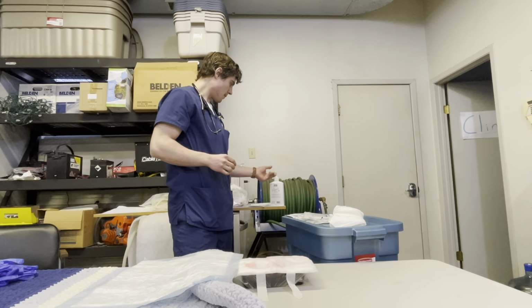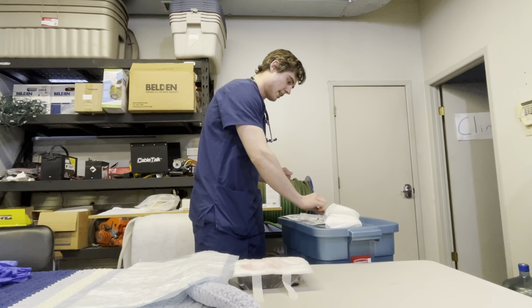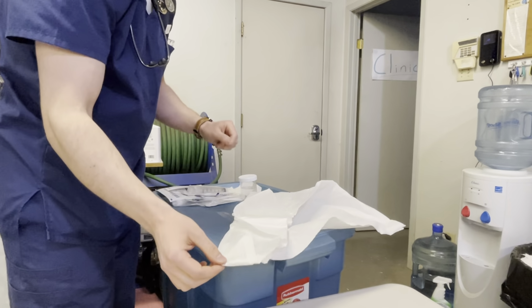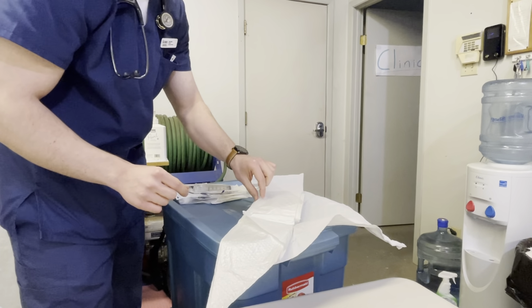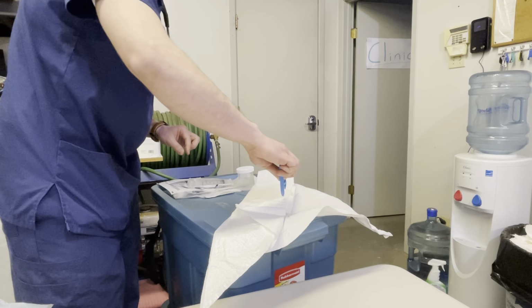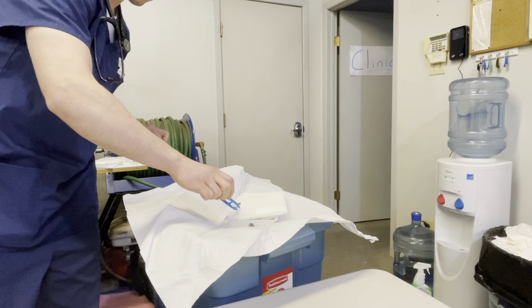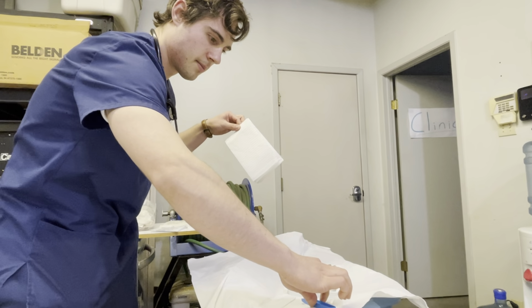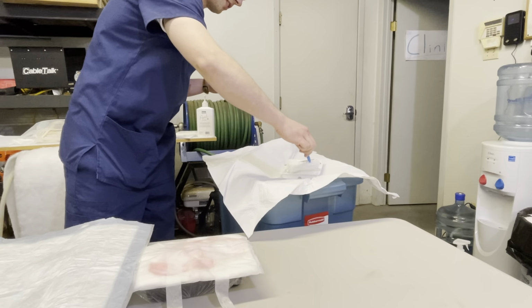I'm going to do hand hygiene again, and I'm going to start by opening our sterile kit. So we'll pull those corners back. Drop. Pass that to myself. Make sure that that's in the 1-inch border. We won't need that.